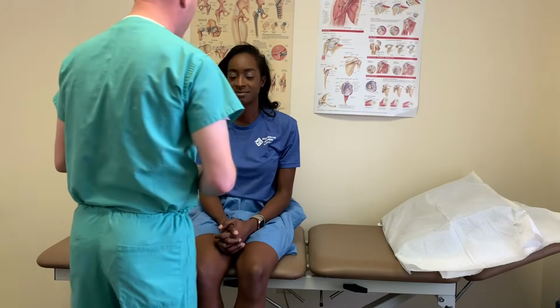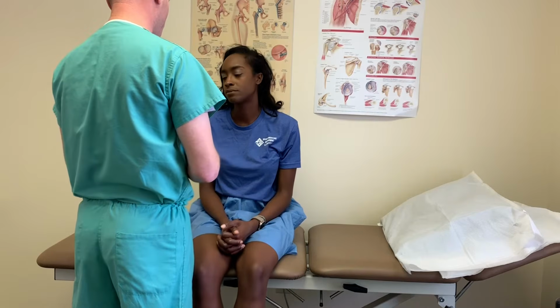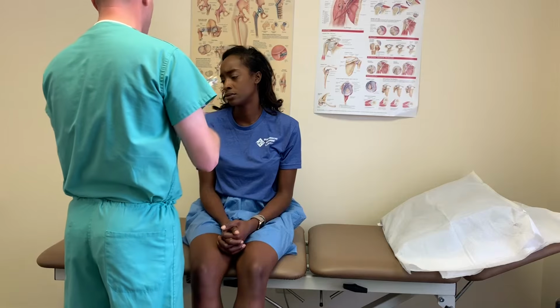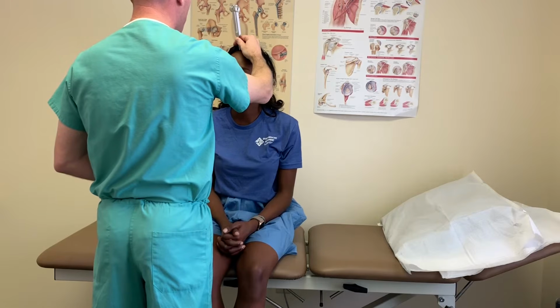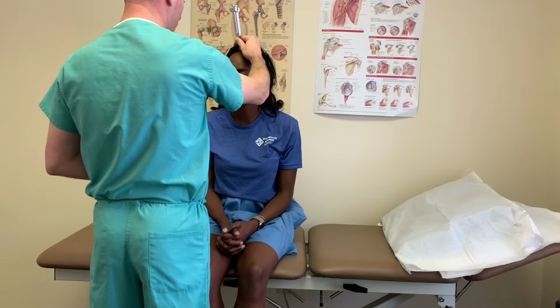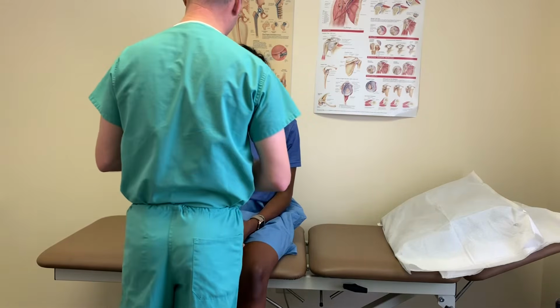If we saw any evidence that you missed a number or letter, we would proceed to the tuning fork test. What I'm going to do first is the Weber test. I'm going to put this in the frontal area of your skull. Tell me if you hear the sound stronger in either ear, or is it equal? Equal on both sides? Okay, very good. That's a normal or expected finding.